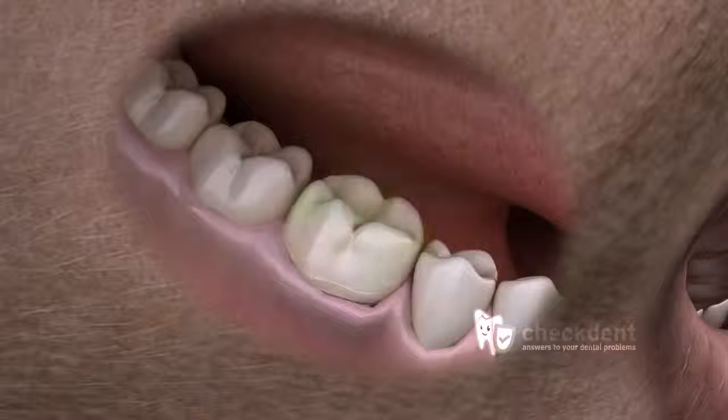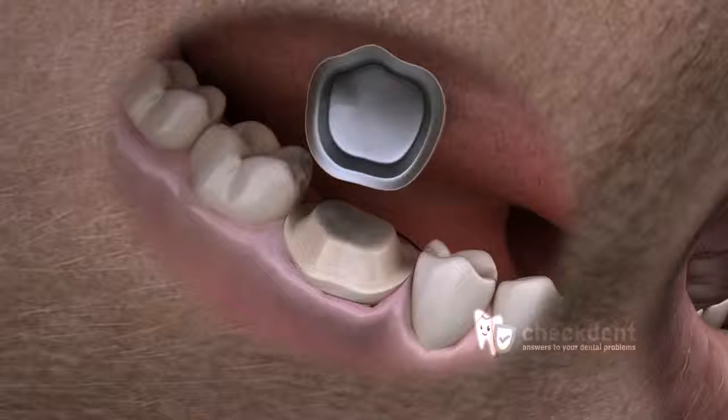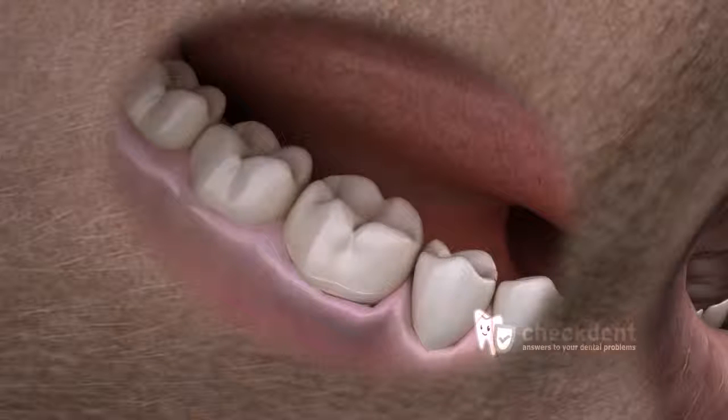The tooth crown is the part of the tooth that is visible in the oral cavity. In layman's terms, the artificial covering that is fixed over a damaged tooth is called a dental crown. There's a difference between the functional and aesthetic characteristics of a crown.